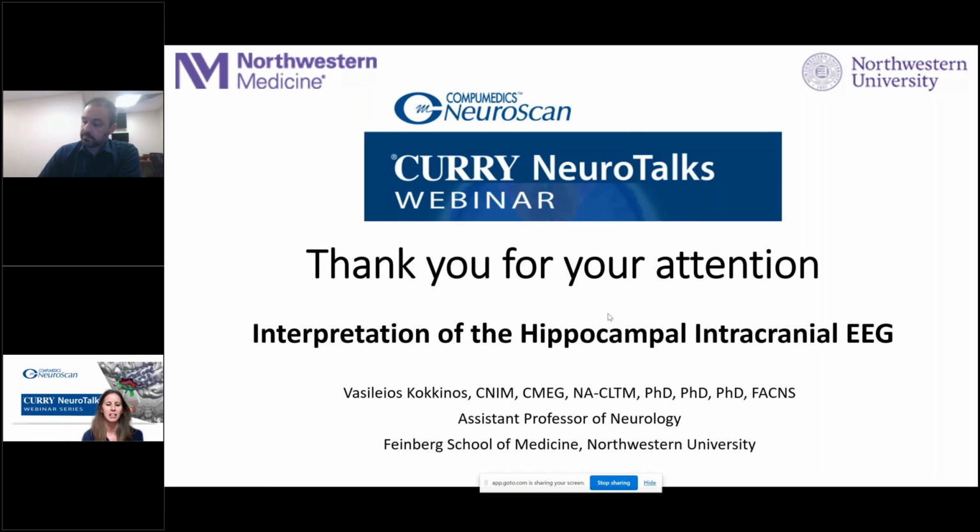that your talk really highlighted the importance of intracranial EEG for getting information about the hippocampus and other medial temporal regions, but also, really importantly for the audience, the practical considerations of both placement of those stereo EEG leads and also interpretation of the data that you record, and how you need to be careful and conscientious about how you interpret and look at that data. And I really think that this type of recording will allow clinicians, and obviously has allowed you and your colleagues, to start determining what constitutes both normal and abnormal activity in your patients. So that was really great, and I really appreciated it as a non-clinician.